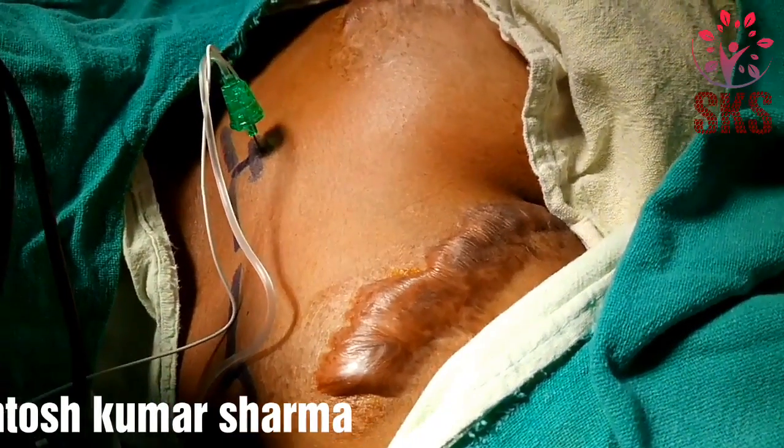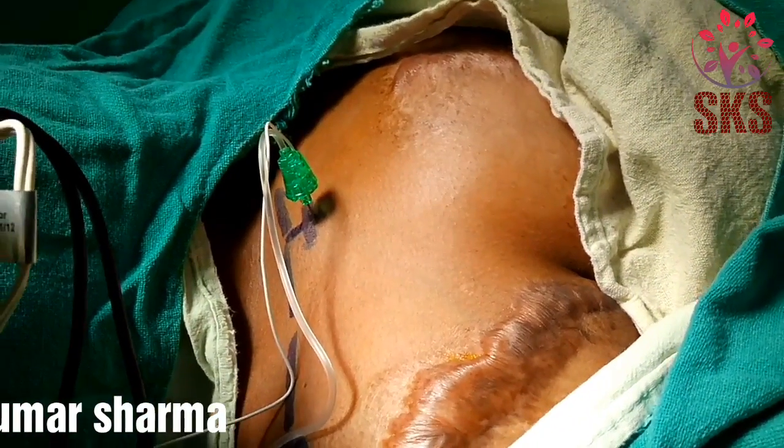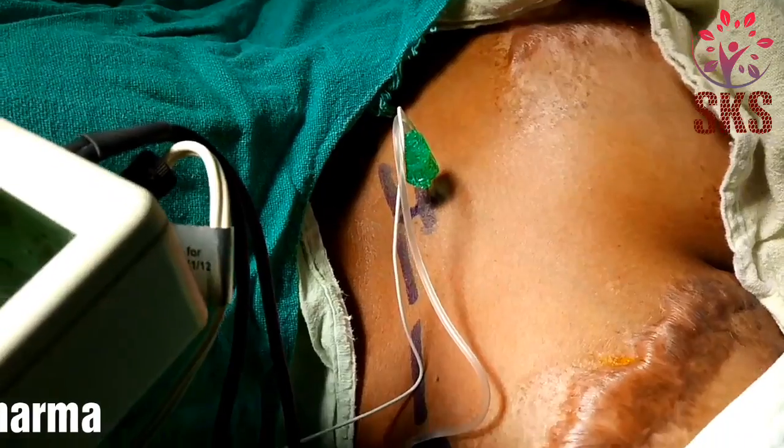This is a 5cm needle. One should not go beyond 4cm depth. I am at 4. That's all.